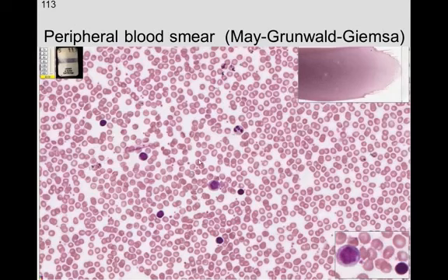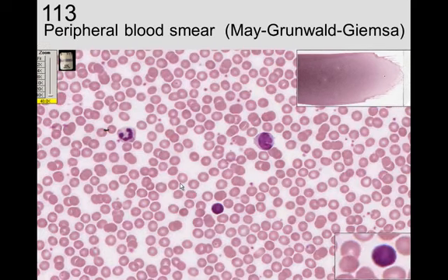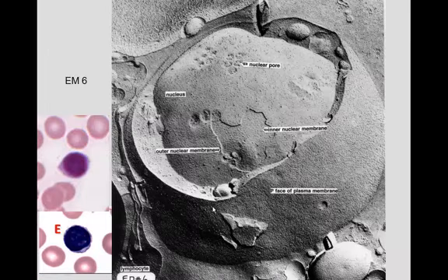Slide 113, another monocyte in through here and there. Lymphocyte, neutrophil, and we can see some little small things in here which are the platelets. Another monocyte, a nice monocyte here. Lymphocyte, red blood cells, and the smaller units here we see are indeed platelets. Neutrophil, monocyte, lymphocyte.